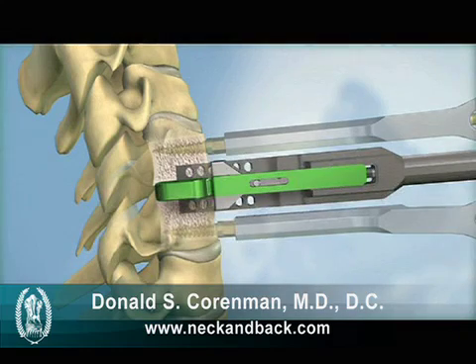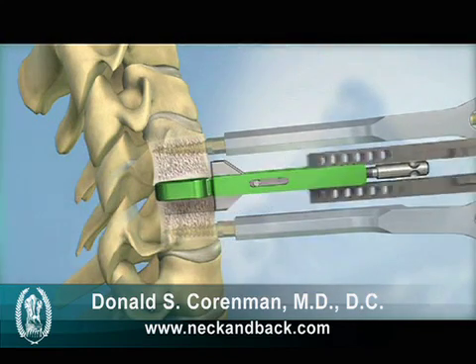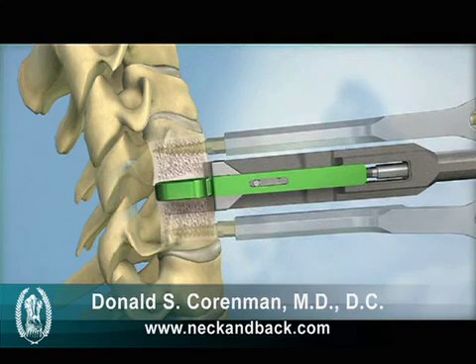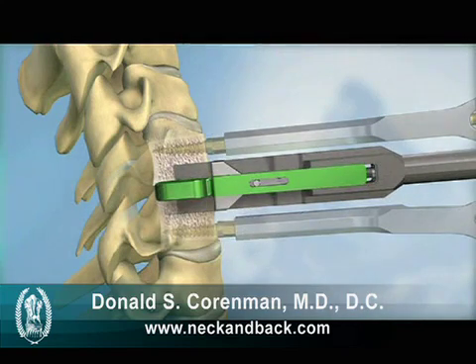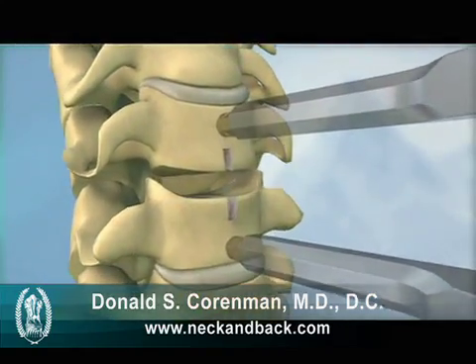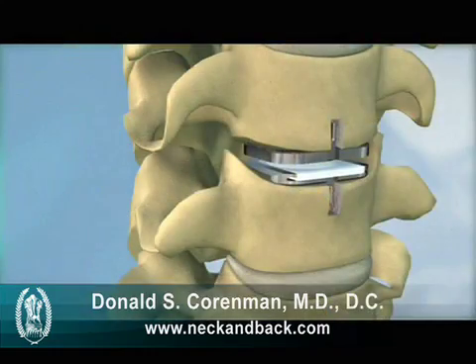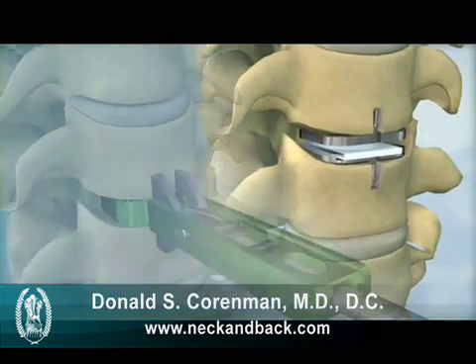First, the primary chisel is inserted over the trial and advanced into the vertebral bodies. The step is repeated with a secondary chisel to remove any remaining bits of bone from the keel channels. Both the milling and chiseling instruments are designed to ensure that the final placement of the implant precisely matches the placement of the trial.